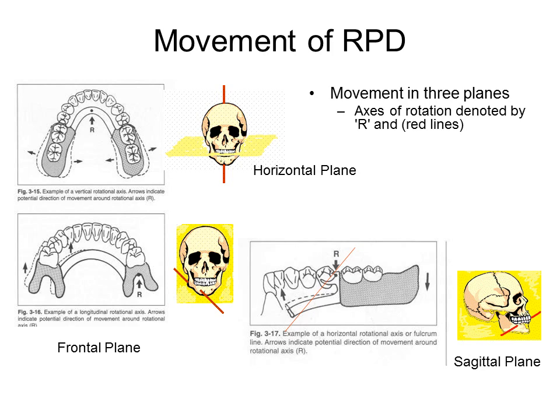The third motion, rotation in the sagittal plane, is described as rotation about the fulcrum line. This typically is the most obvious that may be noticed, although all of these movements may involve low-magnitude forces, which are very destructive over time. Rotation about the fulcrum is minimized by ensuring that indirect retention is planned, and that well-adapted bases are provided.